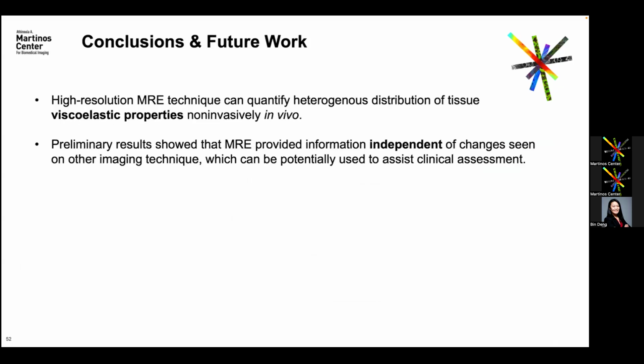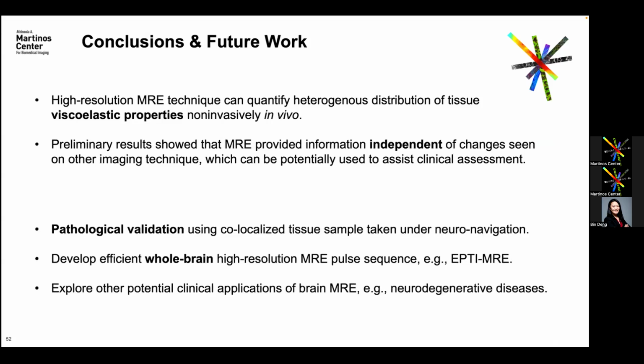So in summary, we have developed high resolution MRE techniques that can quantify the heterogeneous distribution of viscoelastic properties non-invasively in vivo. The preliminary results also show that MRE offers some information that's independent of the changes in other imaging modalities, which can be used to assist the clinical assessment of treatment response.